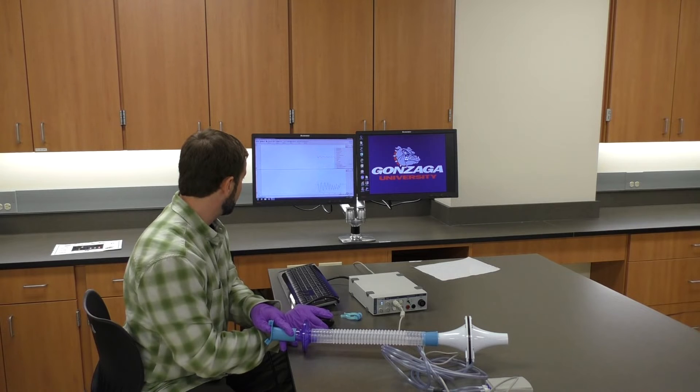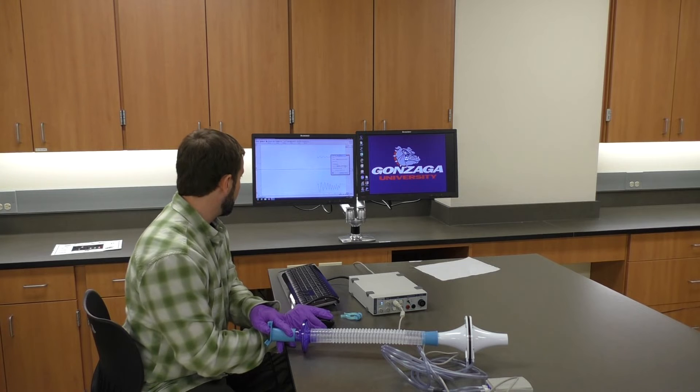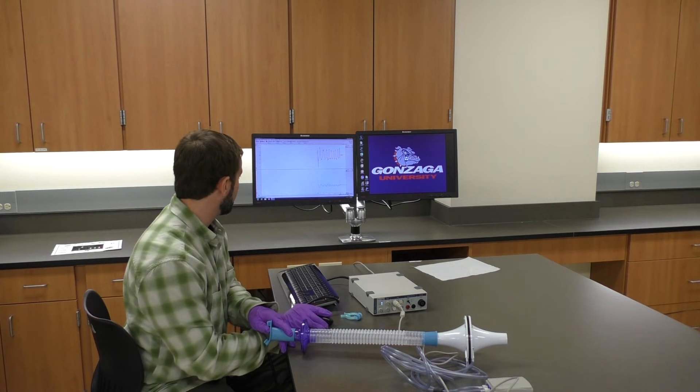I go back into the spirometry flow area and choose the flow head we're using, which is the MLT300L, and then click 'calibrate.' Now I've calibrated this, and everything should be okay as far as the flow channel goes.